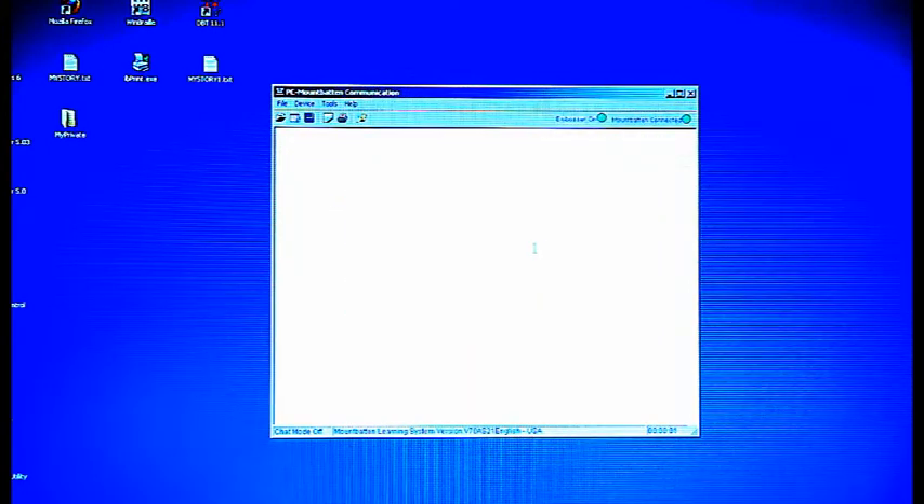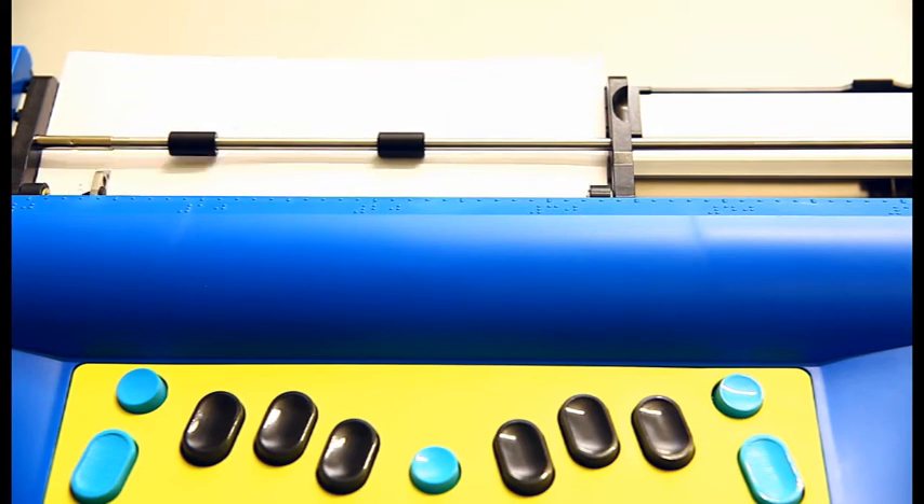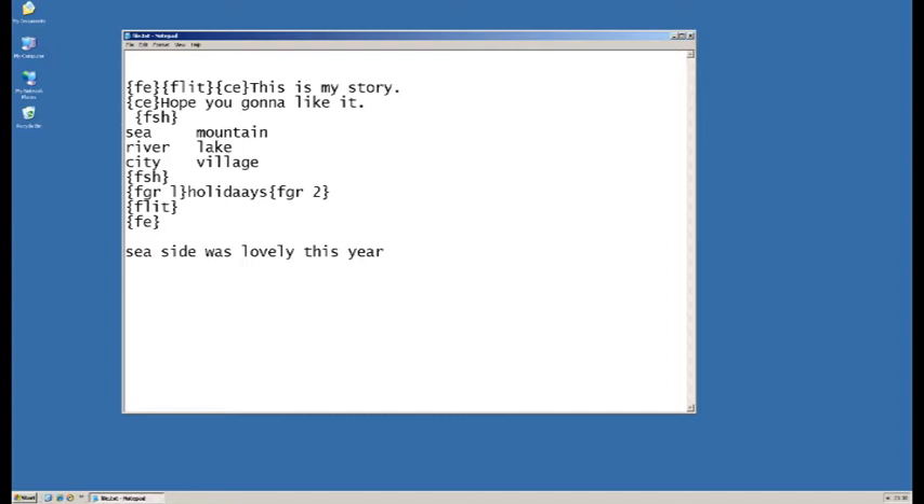To speed up embossing, before you connect the Mountbatten to MBCom, enter CMD-M to turn off the writing speed and activate the embossing speed. A text file to be embossed correctly in Braille needs to have certain commands embedded — the FE and FLIT commands have to be entered at the beginning and end of your file.